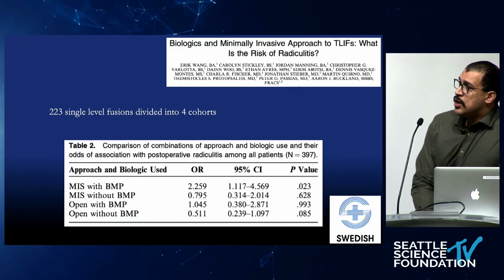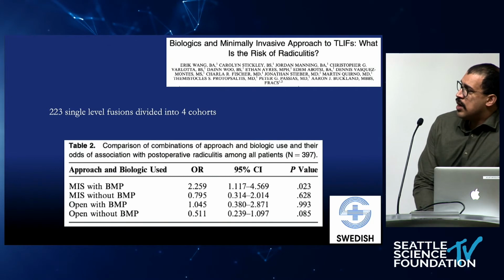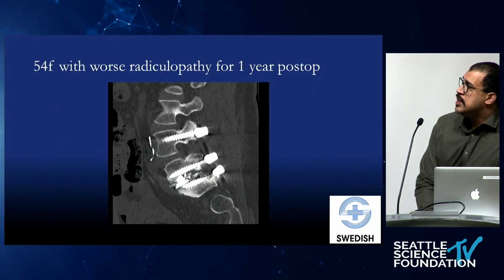I think you can cause it both by that kind of chemical irritation and by banging on the nerve a little bit too much. So again, if you are using BMP in these cases, it is something to be aware of and something to discuss with your patients preoperatively.